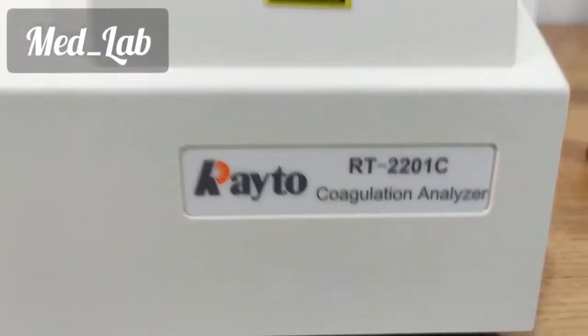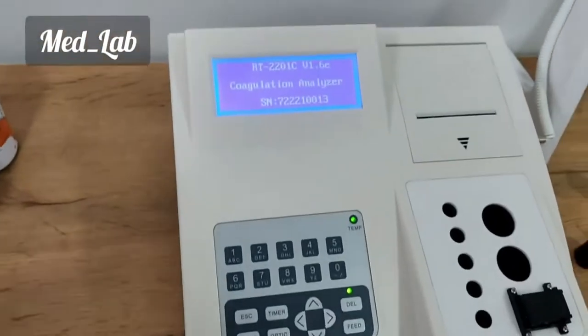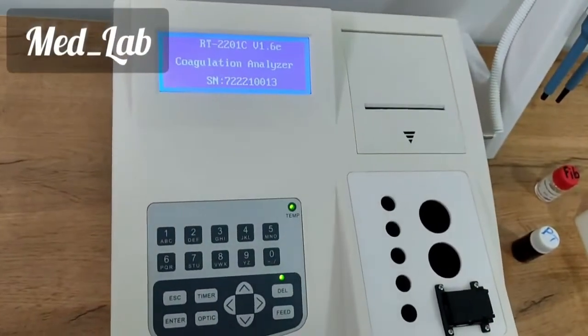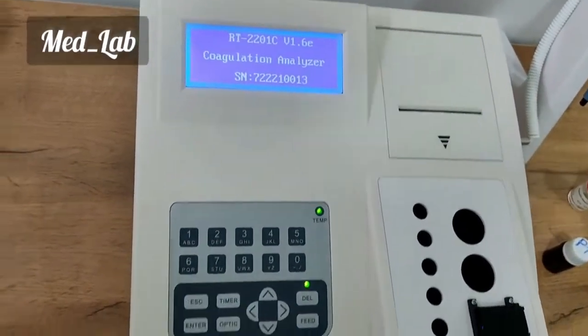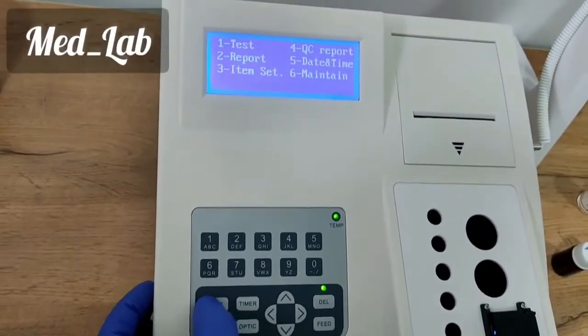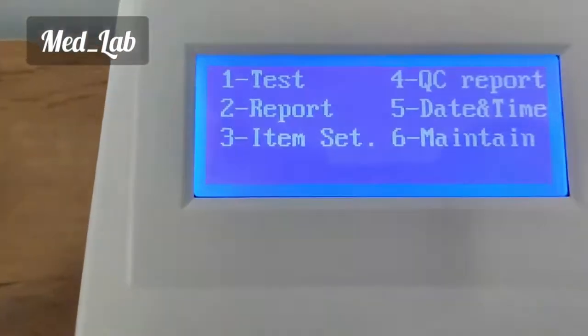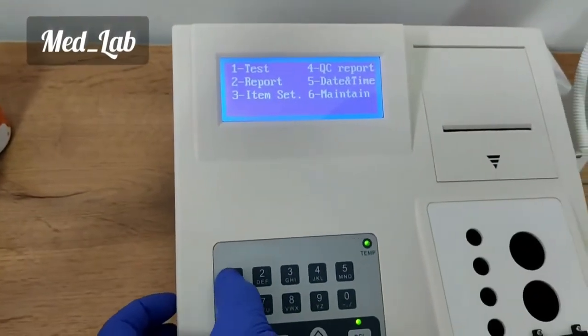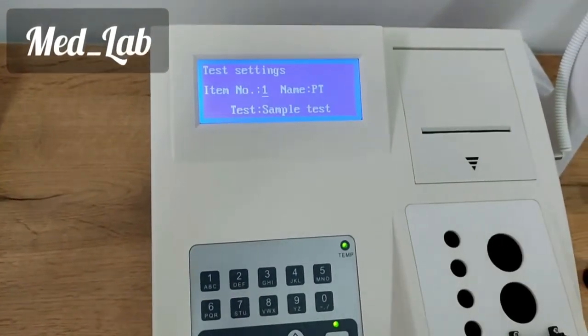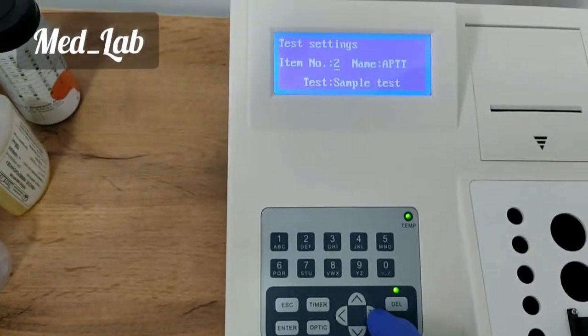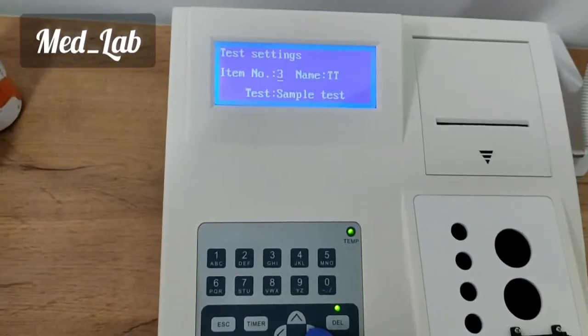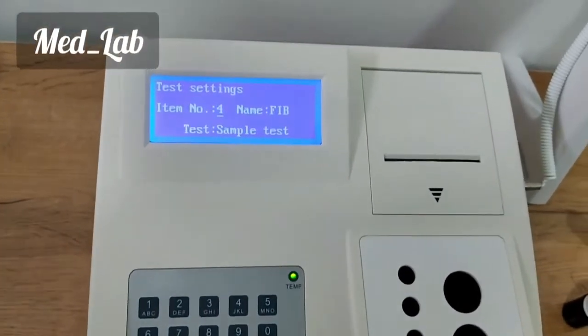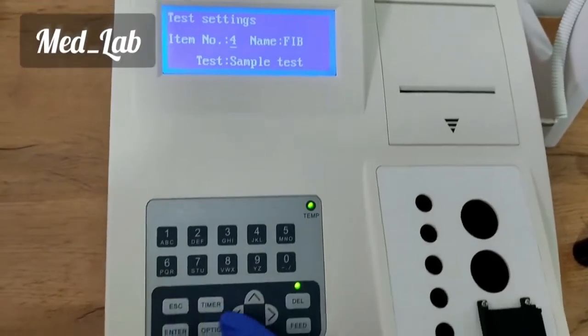RITO-RT2201C Coagulation Analyzer is a single-channel analyzer with a scattered light principle and percentage analysis, which ensures good results. Test parameters include but are not limited to prothrombin time, active partial thromboplastin time, D-dimer, and International Normalized Ratio or INR test.